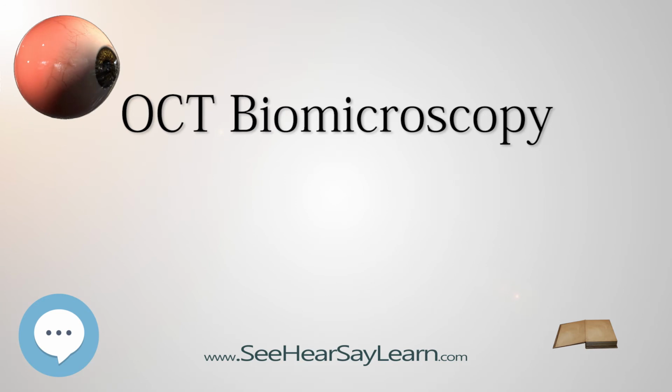At the current time, it is unclear which findings from slit-lamp biomicroscopy might be missed with OCT biomicroscopy, and vice versa. Technology. Until recently, OCT hardware limitations have made OCT biomicroscopy difficult or impossible. Time domain OCT, TD-OCT. The major limitation of TD-OCT that prevents its use for OCT biomicroscopy is speed.